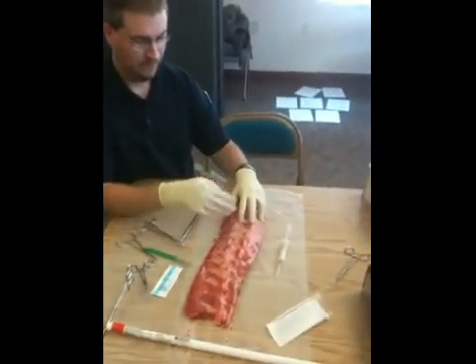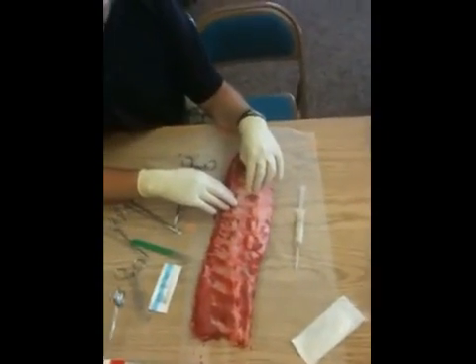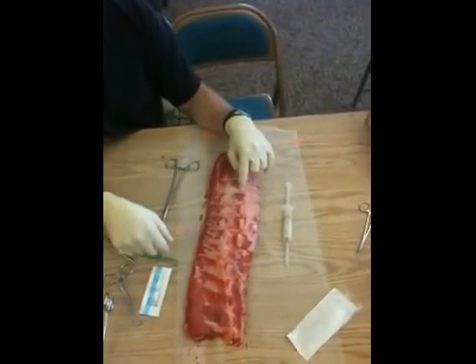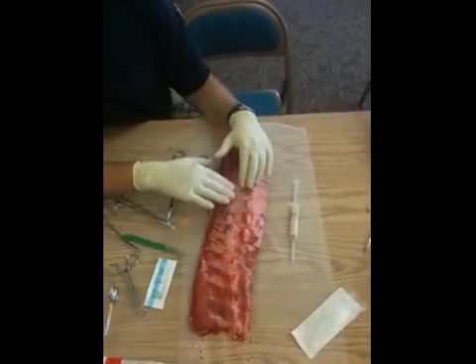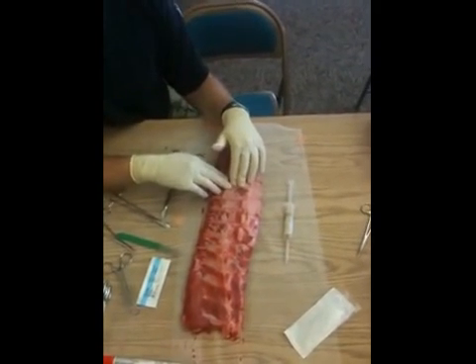I've found my rib, I've infiltrated, I've set up — now I make my incision. I'm going to make my incision on top of the rib. Some people might do this differently; this is just how I do it. There are other techniques, and I'm not going to say they're wrong by any means.